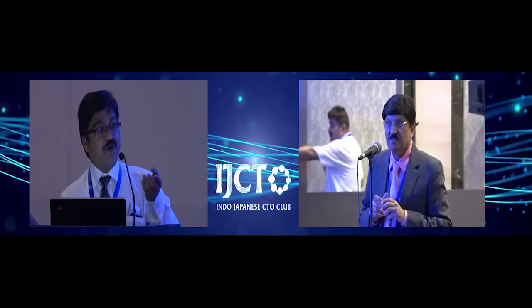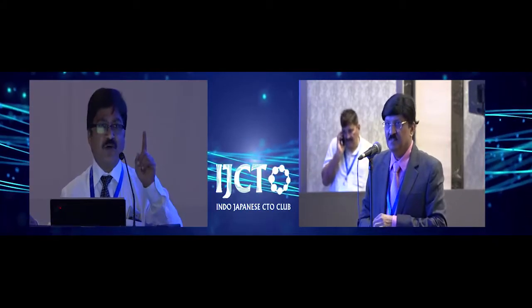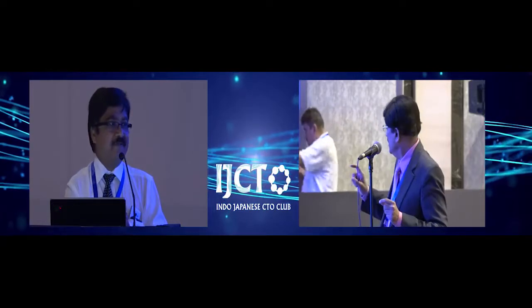So I will just add one more point there. When you are using trapping for the Crusade catheter, trapping balloon plus Crusade catheter, you need at least 7 French. So I always do my CTOs with 7 French, point, Dr. Goel.